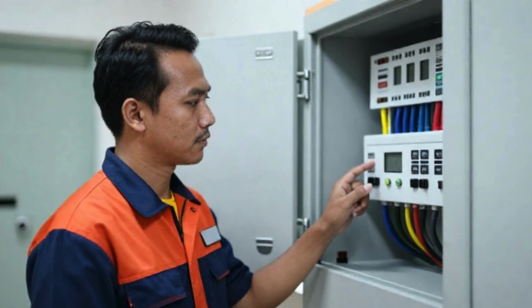Human factors also play a significant role in electrical safety. Improper handling, unauthorized modifications, and lack of training can compromise the safety of medical equipment. For example, using damaged power cords or connecting devices to incorrect power sources can lead to serious hazards. Therefore, user education and adherence to standard operating procedures are essential components of hospital safety programs.